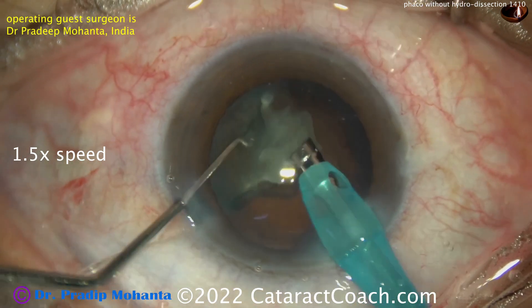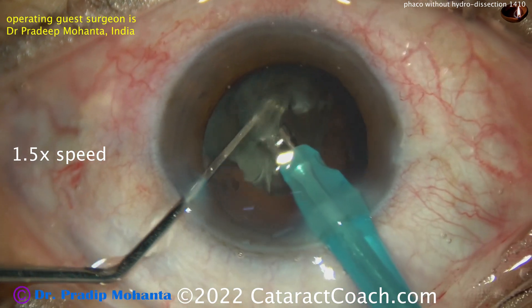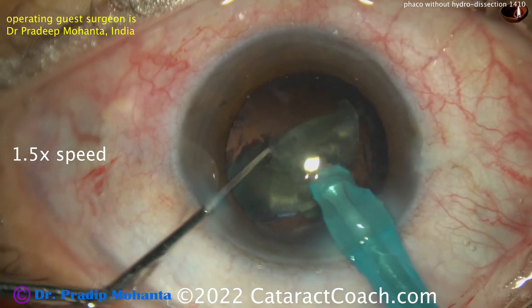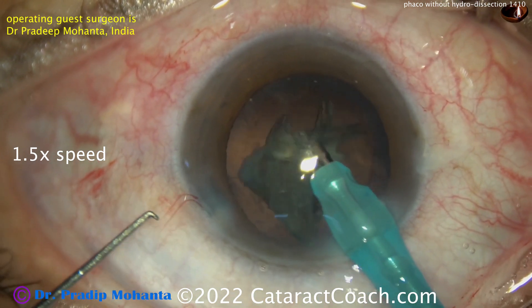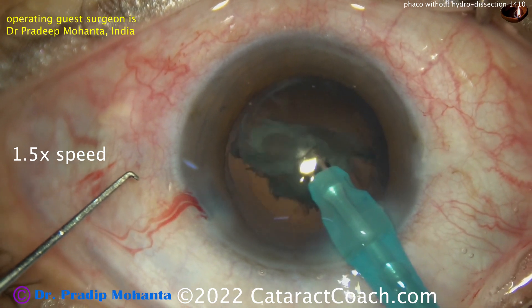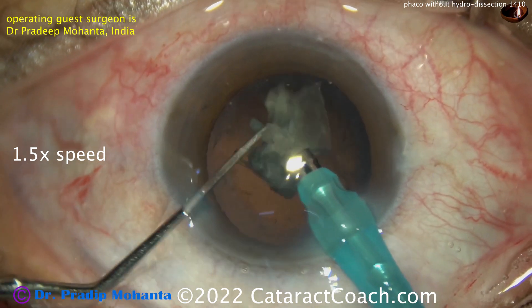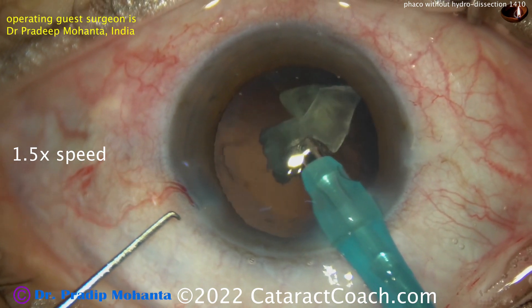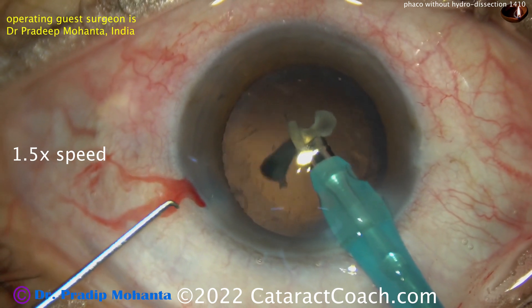In a case where you have a very dense or whitish cataract, you may already have liquefaction of the lens cortex, which makes it pretty easy. At the end, a little more phaco and the last couple of nuclear pieces go down. You can see there's really not a whole lot of cortex left here — a nice technique to keep in mind. You may wonder why the surgeon came out of the eye with the Sinsky hook or chopper.